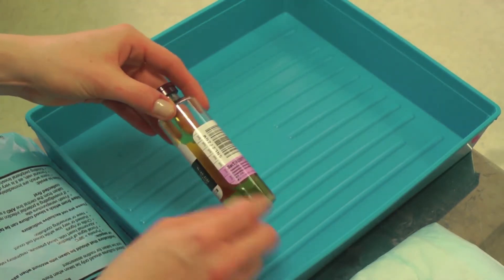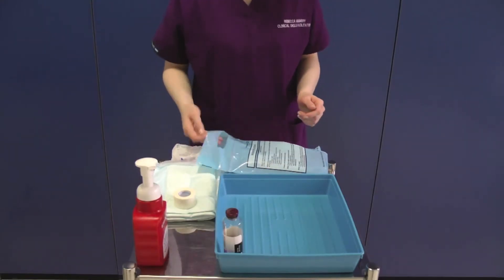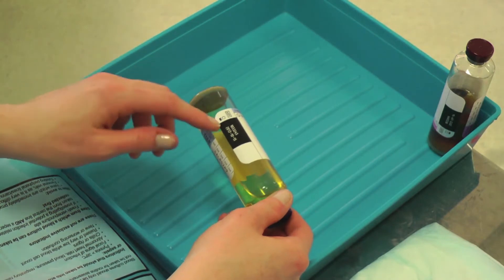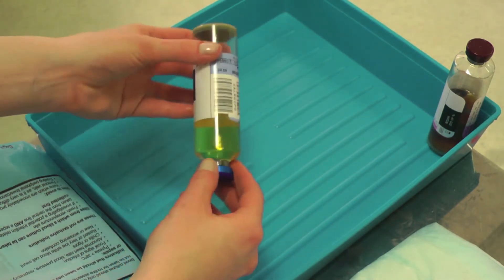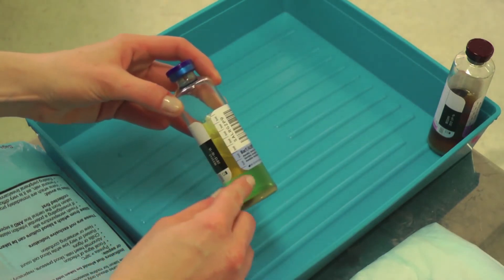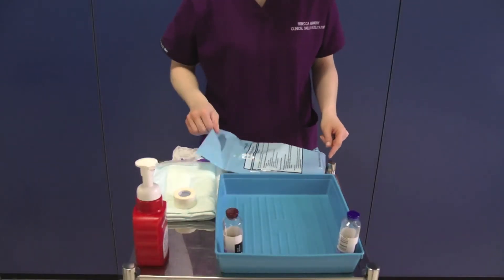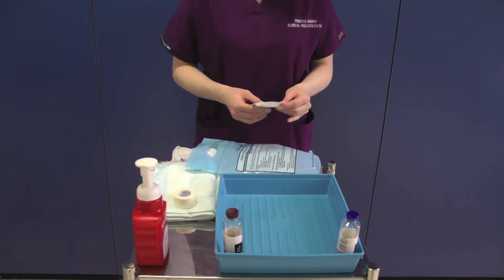There is a milliliter scale on the side of the bottle to help you take the correct amount of blood. Repeat this process for the other bottle. Remove the rest of the contents of the blood culture collection bag, checking the expiry dates of the equipment when appropriate.